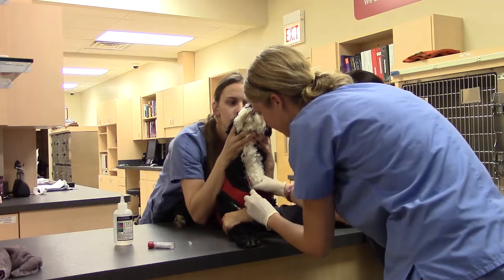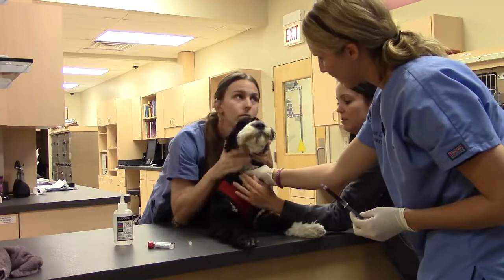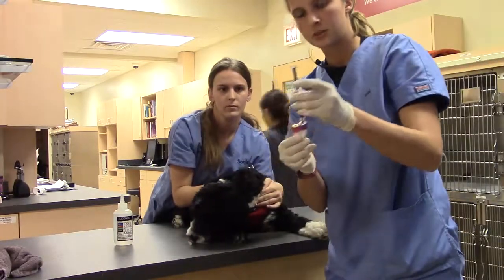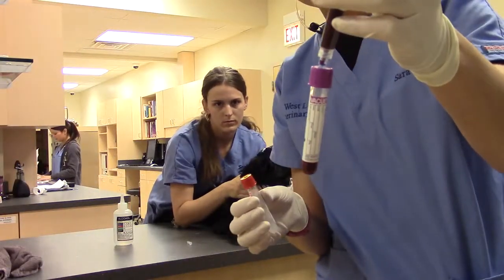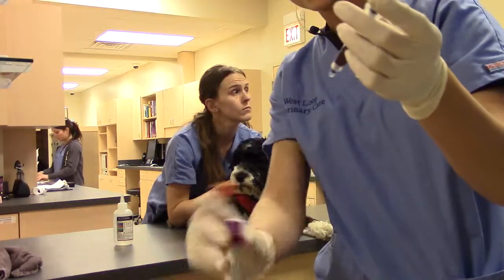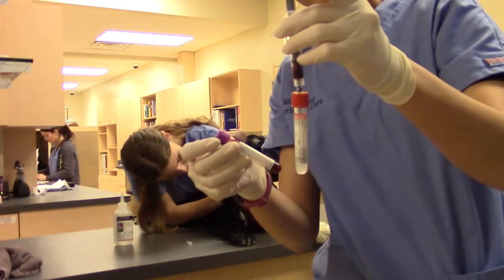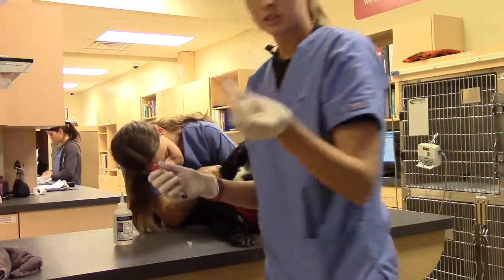I'm going to release pressure and put some over the site where I poked, and then have Sonia hold off so we make sure we don't get a hematoma. I'm going to go ahead now and fill my tubes, making sure to let the vacuum suck in the blood and make sure that it gets the correct amount. And then I'm going to dispose of this in the sharps.